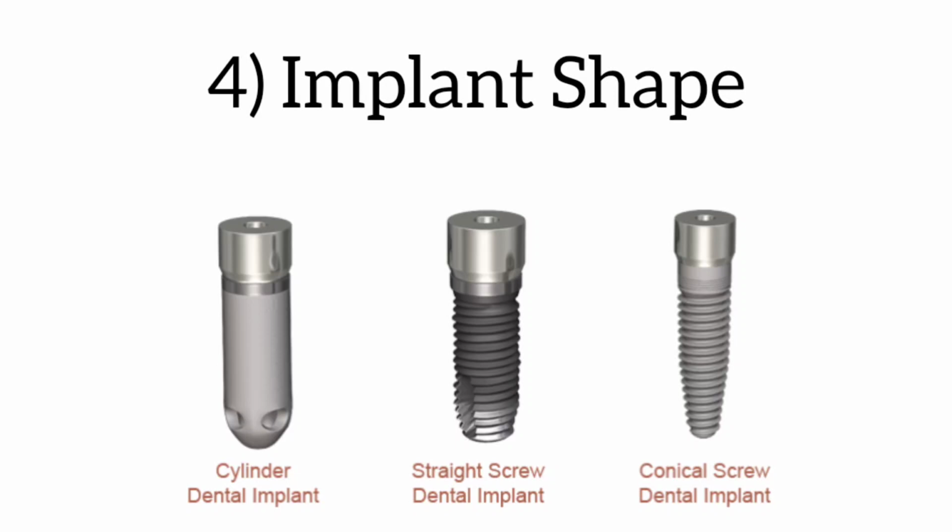However, in D4 bone quality, tapered implants have shown more favorable outcomes as they reduce the stress on the bone while being screwed in due to their conical shape. To summarize, depending on the quality and quantity of bone available, the implantologist will select the right implant for you.